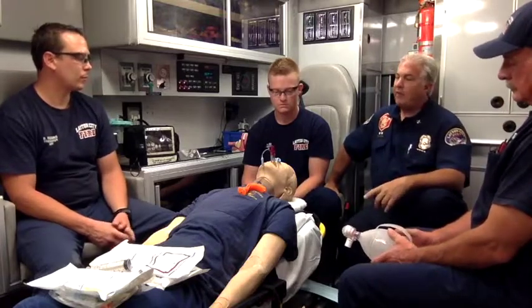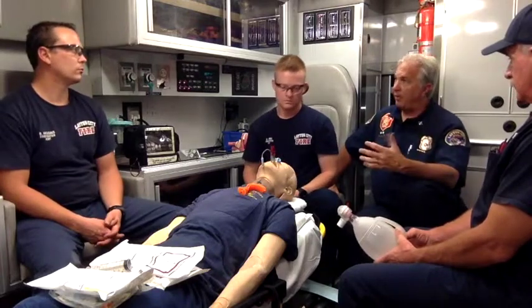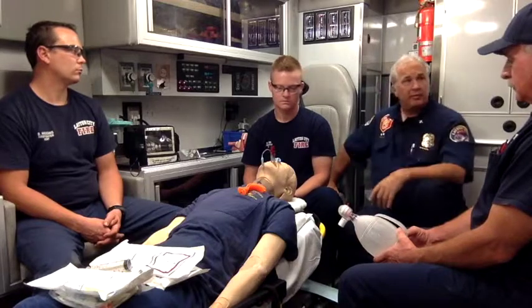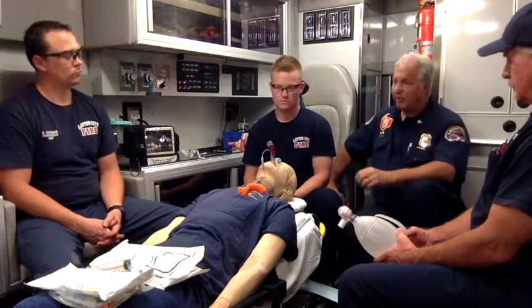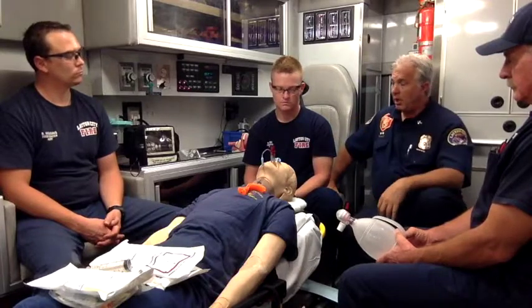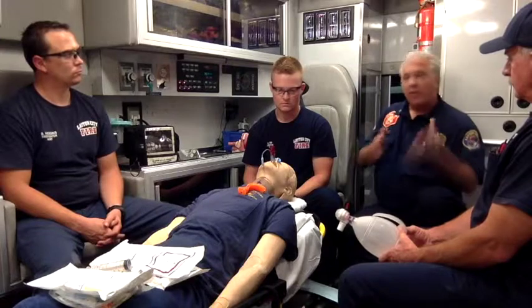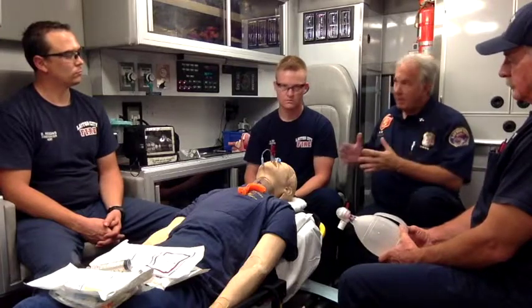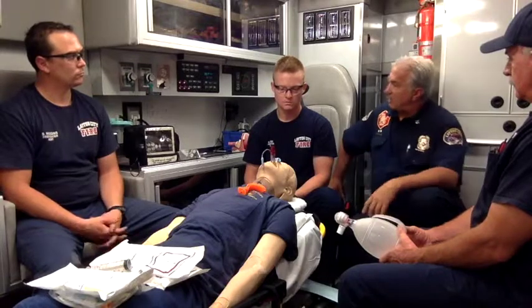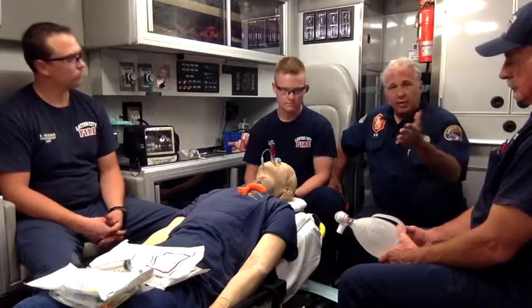However, if for whatever reason your medics on a call are finding that they have to stop CPR, then the answer needs to be we need to go to this. If the intubation is so difficult that we have to stop CPR, then we should be going to this instead. And so the studies are kind of a mixed bag. They're leaning more towards you probably can use them, but there's also evidence that it maybe does have an effect on our survival rates. So look at those studies.